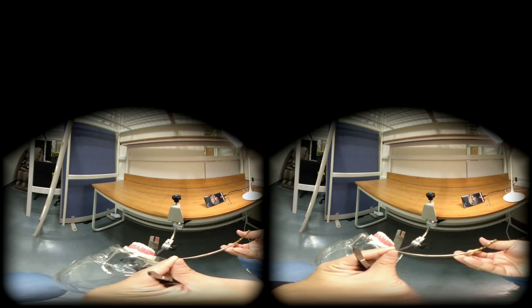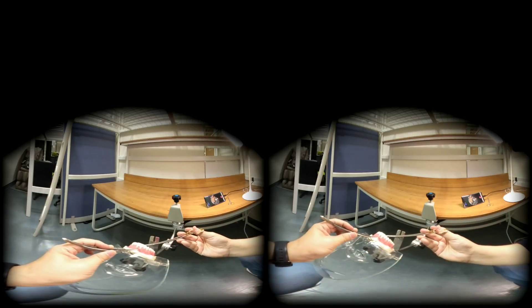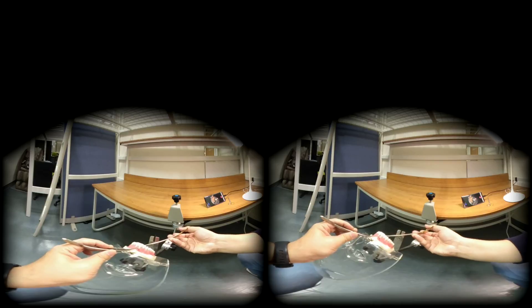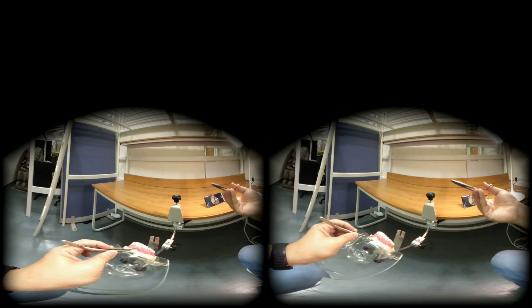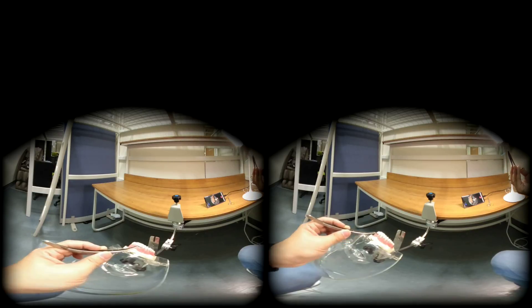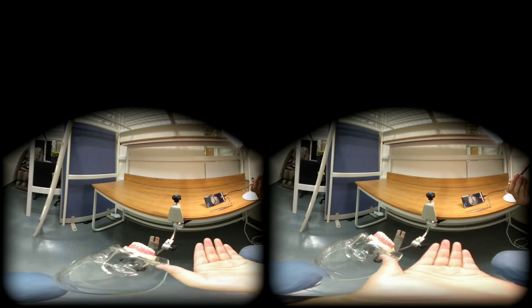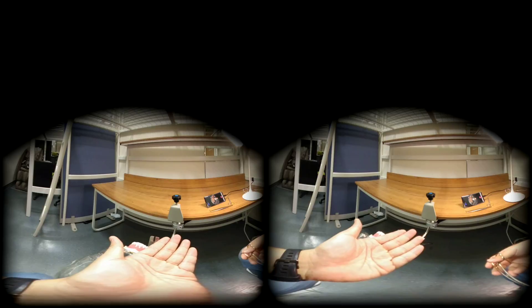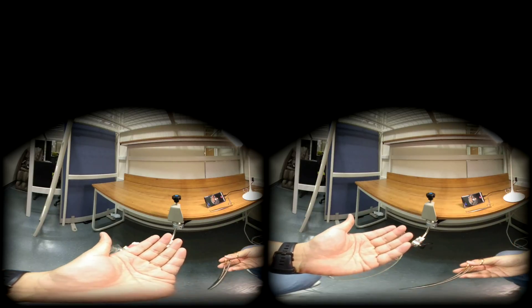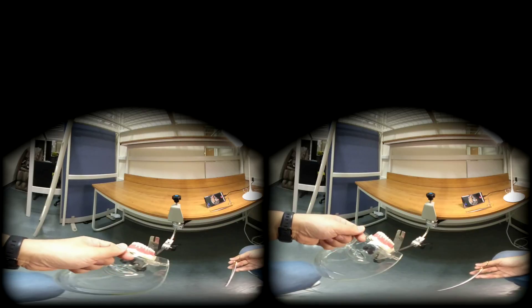Now you rotate your needle, and you enter from the lingual aspect and you come out of the buccal aspect. Now you have fully engaged the buccal flap and the lingual flap. Now you can get rid of the needle holder like this. Your silk drops on top of the left palm, the needle can drop. And we are ready for the surgeon's knot.